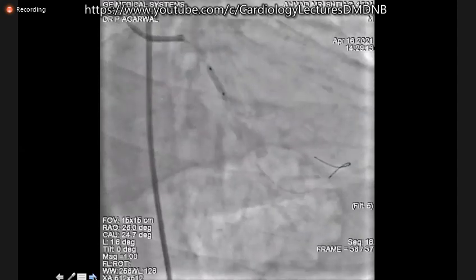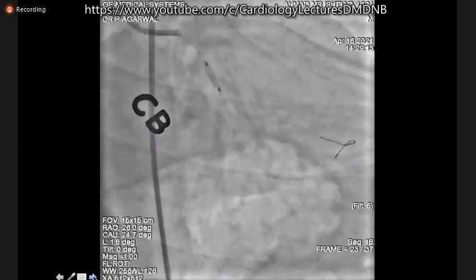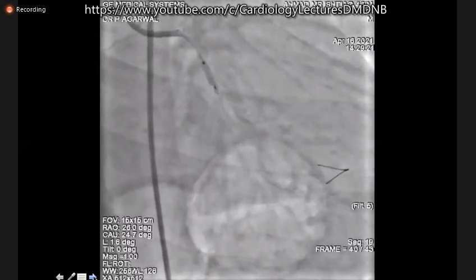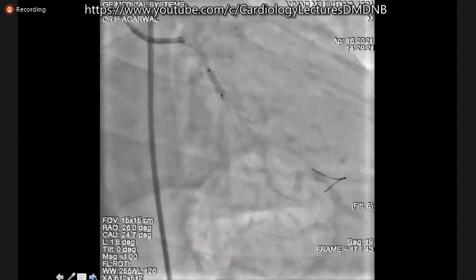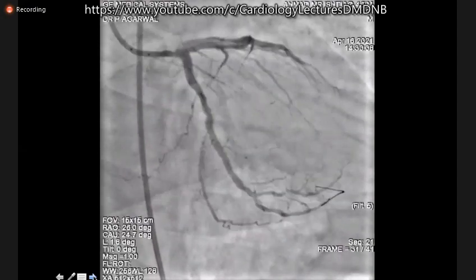So that's the 3.25 cutting balloon initially. It's a reasonable dilatation. I go very aggressive about this, at about 16, because I'm undersizing the cutting balloon. So I'm going to about 16 or 18 atmospheres on a cutting balloon. I took a shot, still not happy.